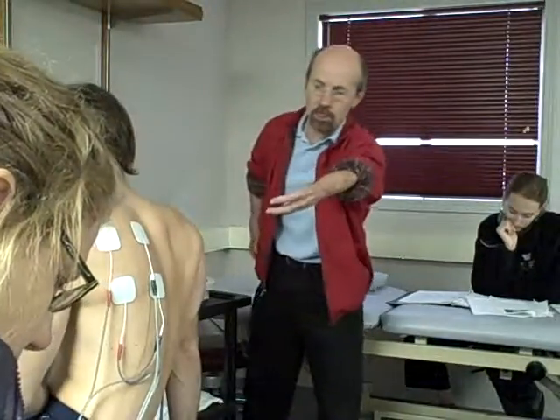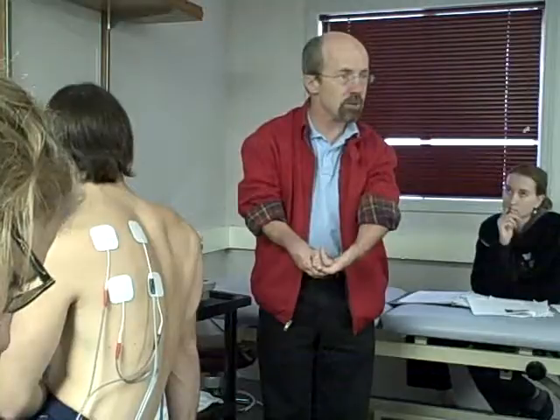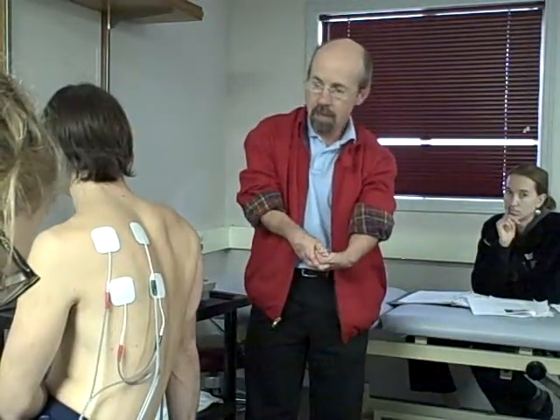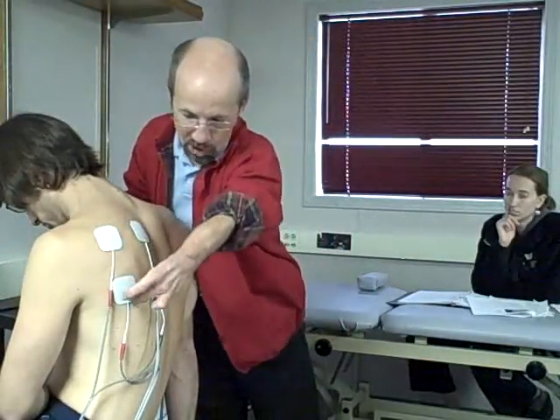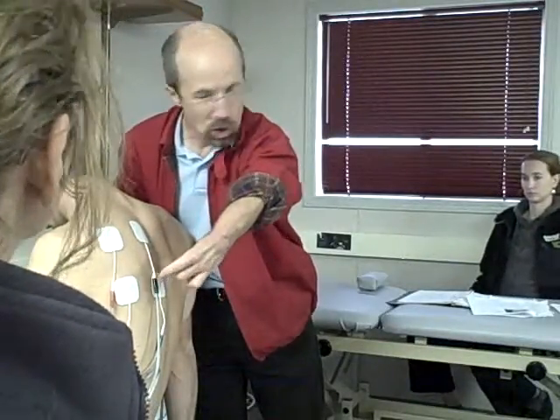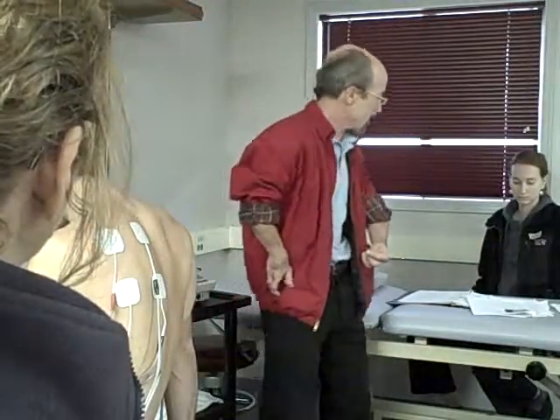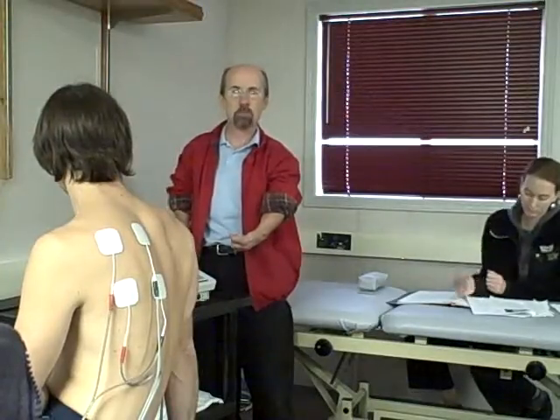Okay, so we all understand the basic principle with quad polar. It's a pain management objective. It's very comfortable. I can treat deep, and we're treating in this area right here. Our target area is not here. Yes, there's stim coming out directly underneath the electrode, but it's got to run to that one to complete the circuit. So our focus is not here. Our focus is there. That's all we're saying. The focal point is where they need it.